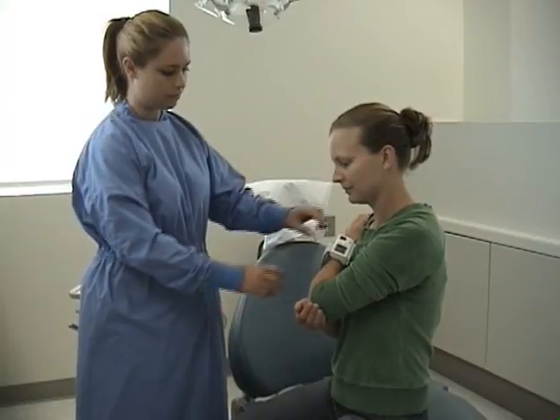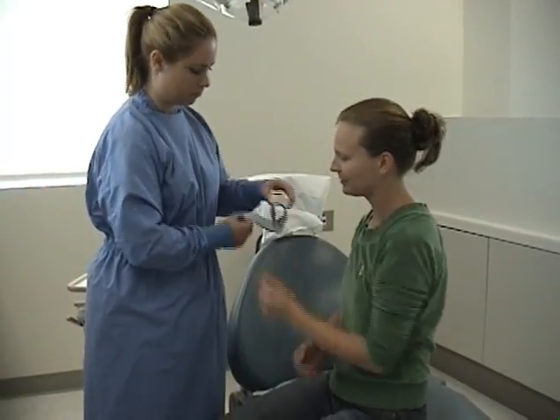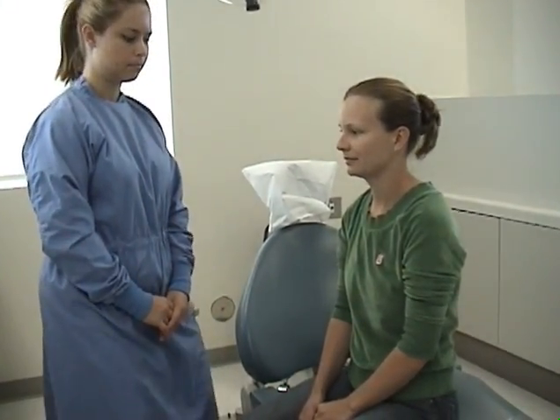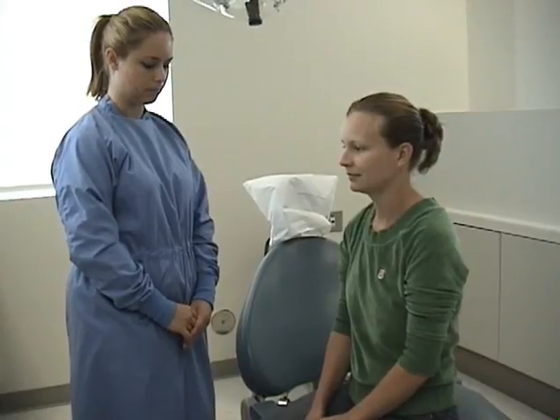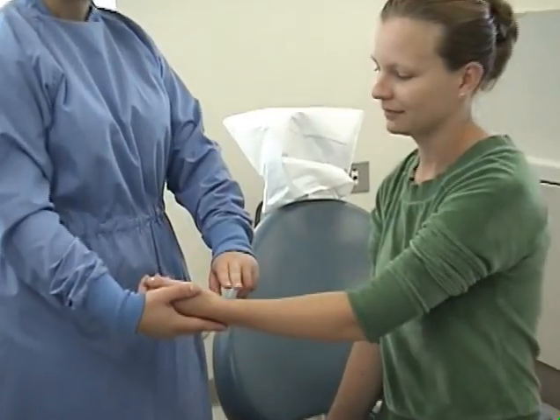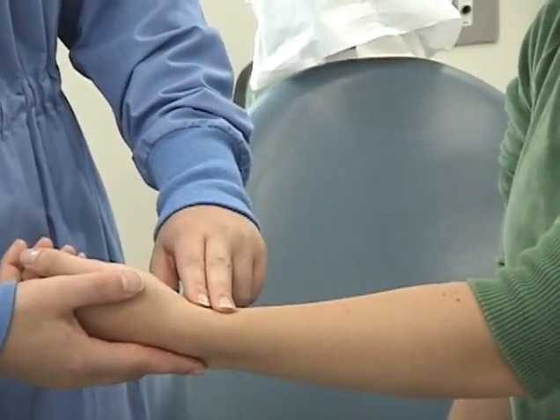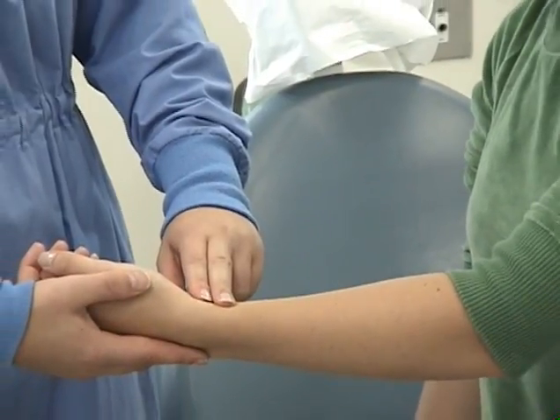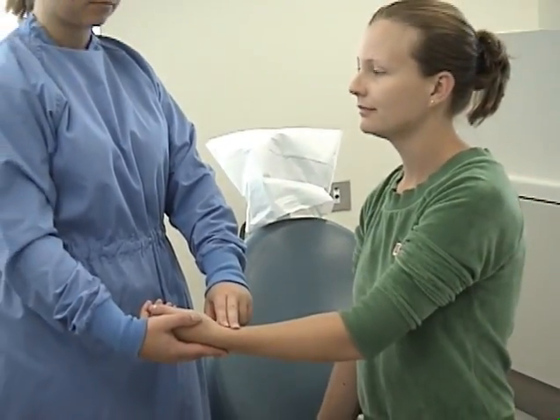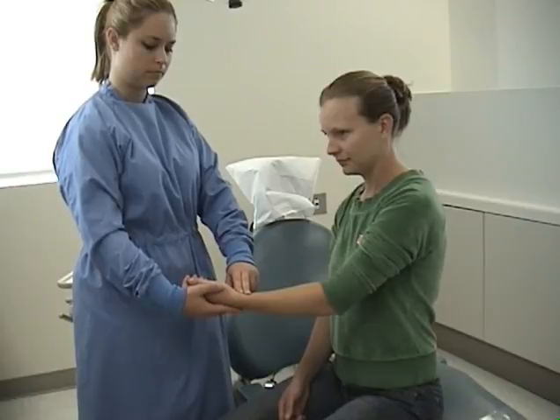Remove the cuff. After removing the blood pressure cuff, take the patient's pulse for 30 seconds using the pads of the index and middle fingers on the inferior aspects of the radial artery. You will double this pulse reading and compare it to the 60-second reading you have on your cuff. While still holding the patient's wrist in the pulse position, take respirations.